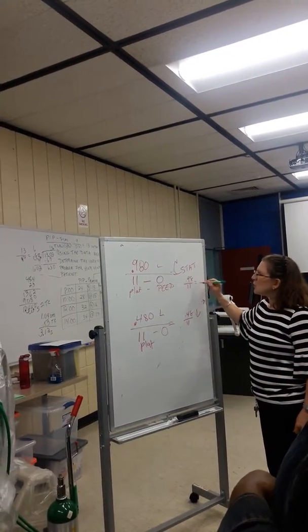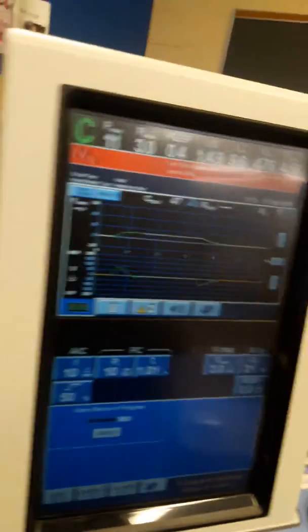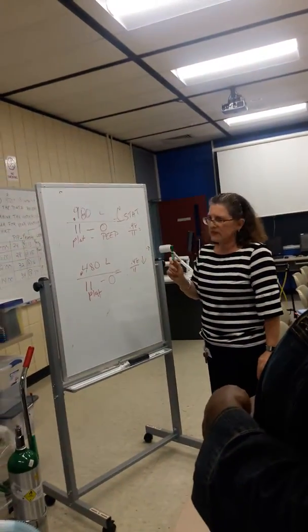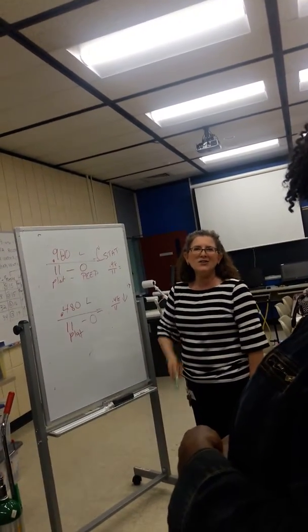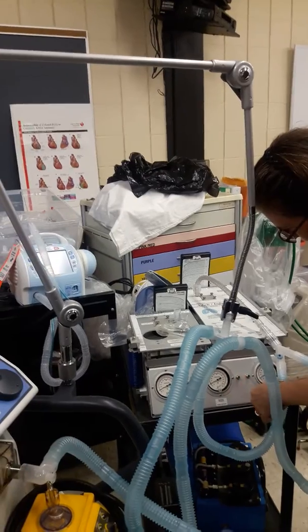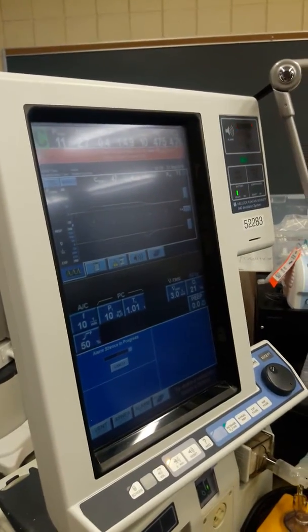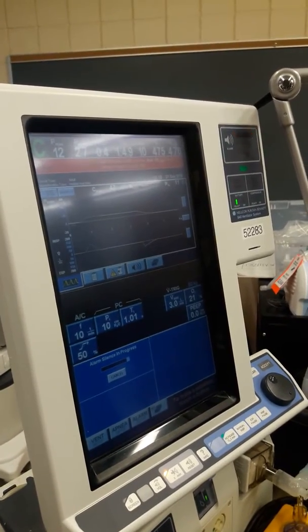The problem here is that because I am using a mechanical simulator, I don't believe I can change the plateau because it's set here. There used to be something on here that I could change, but there's nothing there anymore. So I can't really model it here.